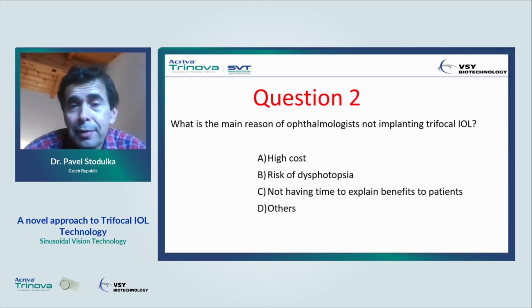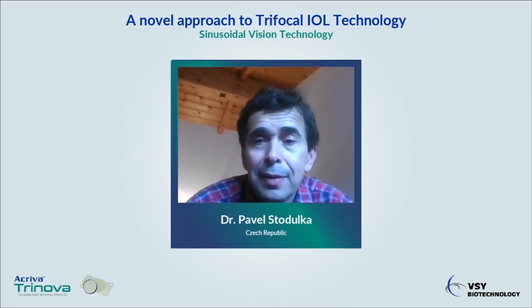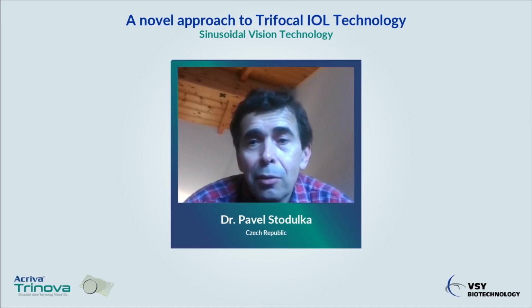And the others, I think there is a plethora of different reasons which might prevent eye surgeons from using this technology, including the long-term stability of the trifocal lens, the differences in refraction, and the need to fine-tune the ametropia. If we do not hit emmetropia after the surgery, the patients cannot really benefit from the main advantages and become glasses independent. So it is also demanding in terms of precise IOL calculation, and it's also advisable to have access to an excimer laser or some other ways to correct refractive errors and surprises. So we'll see what the other reasons are. Let's have a look at the results.